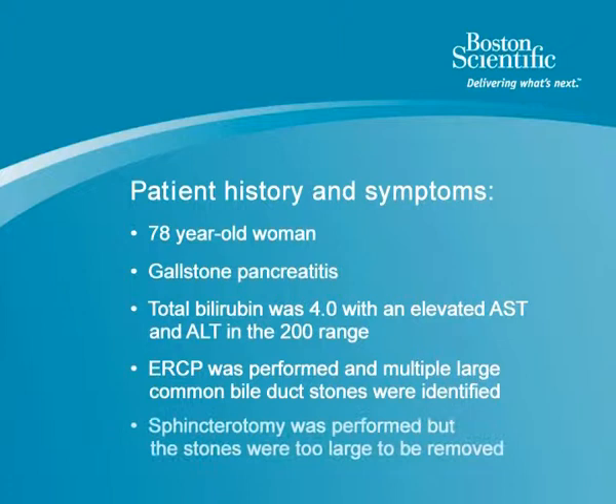A sphincterotomy was performed and stones were attempted to be removed. However, the stones were too large to be removed. She was referred here today for further management, and the game plan today is to do an ERCP and evaluate the size of the stones and then perform a SpyGlass direct visualization examination with the attempt at using the electrohydraulic lithotripter to extract these stones.